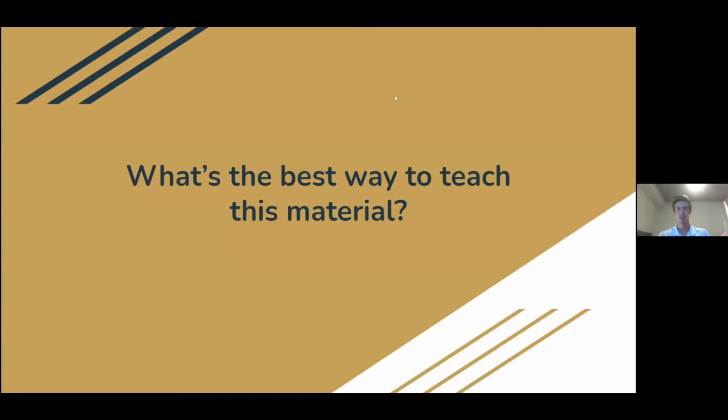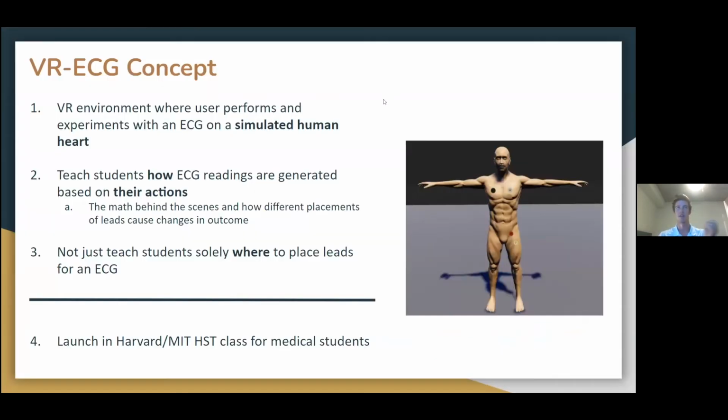So yeah, that leads into the question of how should we teach this spatial understanding of where to place these leads, what's going on in the heart, and how it all interacts. So yeah, that's where our VR-ECG comes in. In the VR-ECG, we have a VR environment where the user is actually able to perform a full EKG and show the generated graphs, the output of where they place those stickies within the environment.